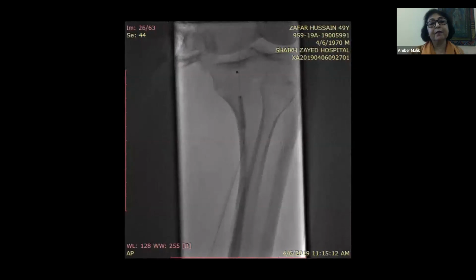This will now just go through. So you can see that this has gone in. So now it's sticking at the CTO side. I don't have a picture in which it goes through, but it does go through. And then we just balloon, balloon, and balloon. You've got a bigger section there. Balloon, balloon.